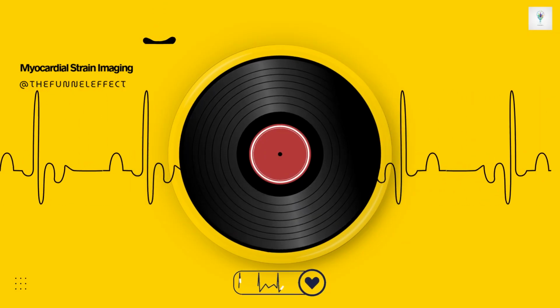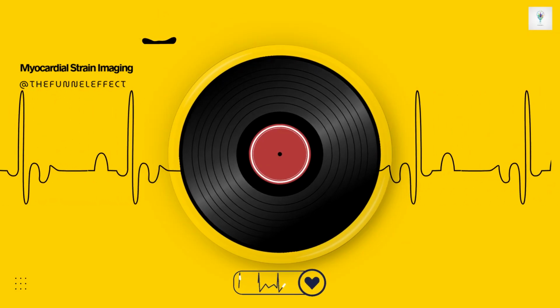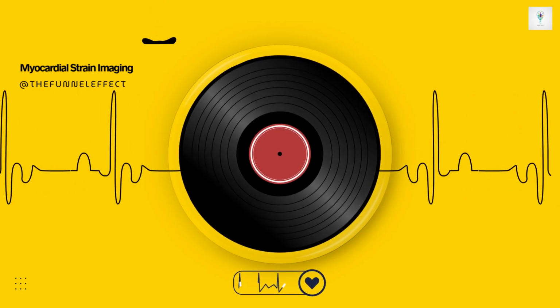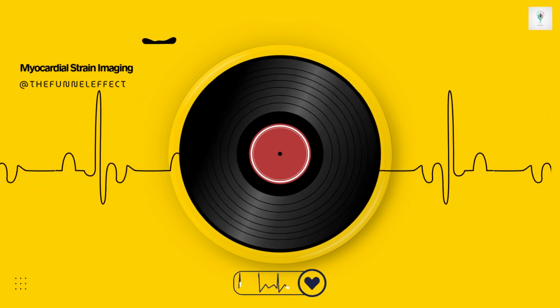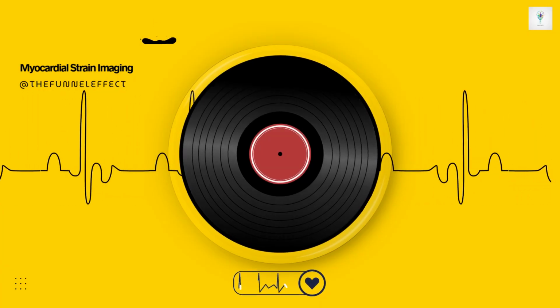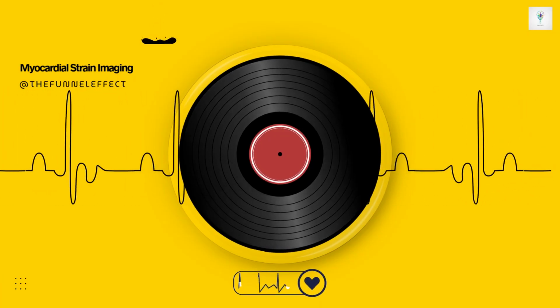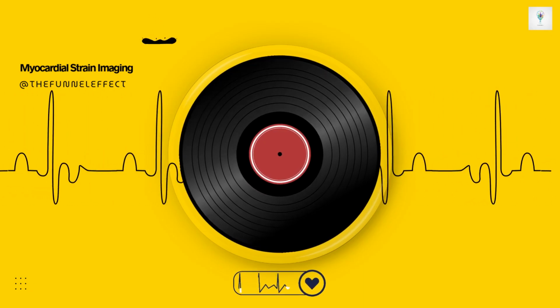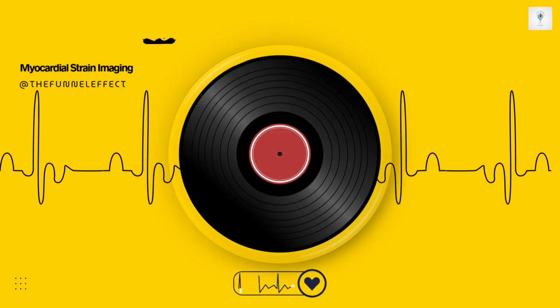And the final factor, which really highlights that strain is a functional measure, not purely contractility, load dependency. Strain values change depending on the pressure the heart is pumping against. Yes, this is probably one of the most important practical considerations for clinicians interpreting serial strain measurements. Strain is not an intrinsic measure of muscle contractility in isolation. It's sensitive to both preload, filling, and very importantly, afterload, the resistance the heart ejects blood against.